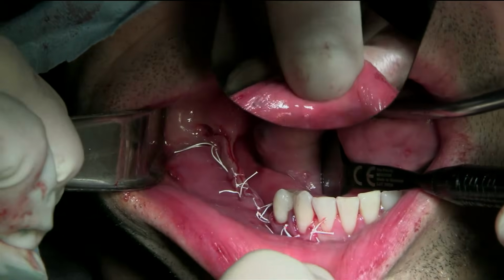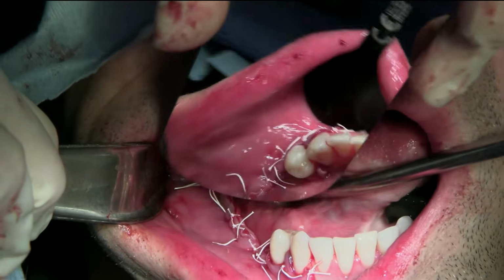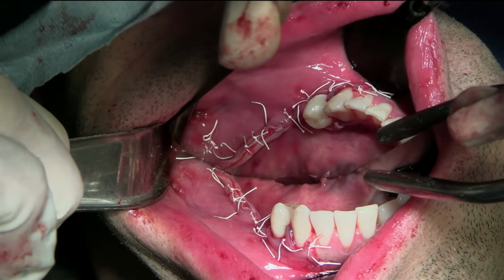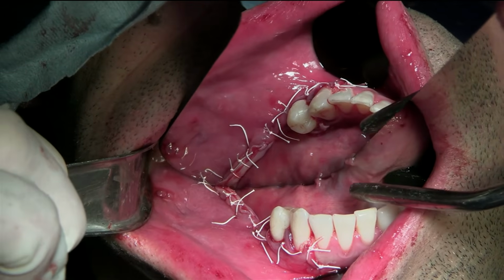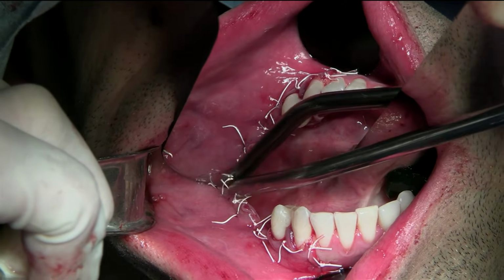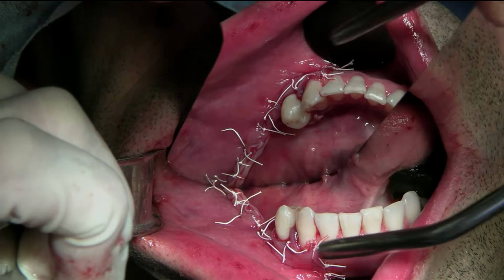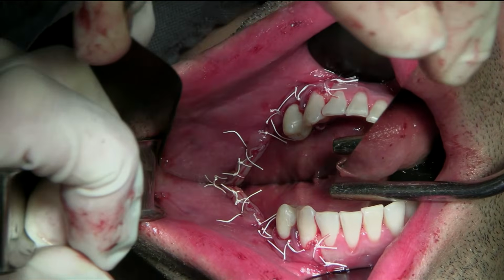online video. Okay, you've got to retract here. Okay. So that's your closure. 2, 1, and then let's do a video. Okay. That looks really good. I'm happy with this. And just for the record, 2 more sutures need to be placed.